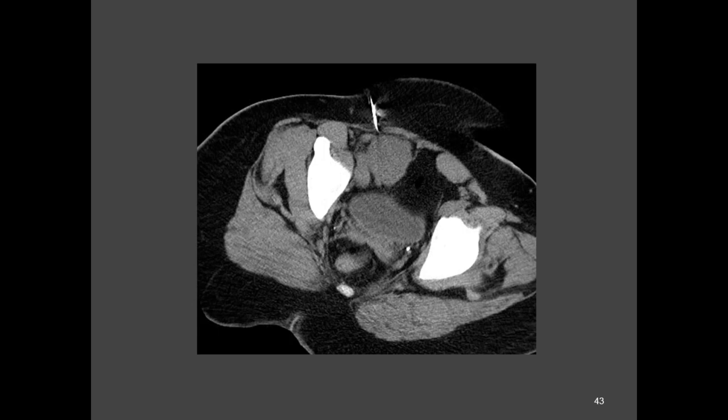Here's a shot of it. I believe that this part here is where they're trying to access whatever part of the body they're looking for. This kind of has that artifact look that a CT image shows for a foreign object. So I'm guessing that's the guidance as far as the picture itself.